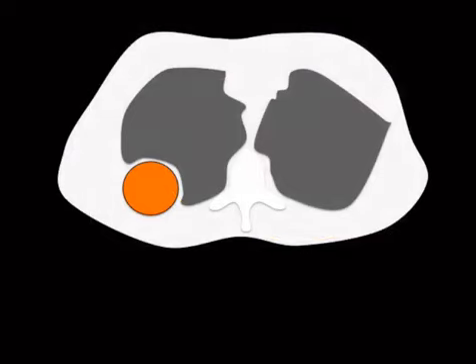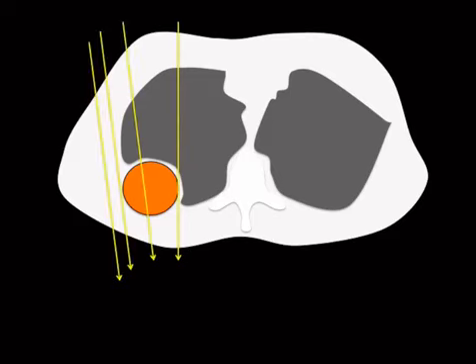So allegedly, the reason that this happens is it's based on the curved nature of the chest, and as you fire your x-rays through the chest, you get a sharp border where you're going through lung, but then when you're not, you've got this tangential relationship, or a lack of tangential relationship, that causes it to blend into the chest wall. So the shadow becomes more ill-defined.